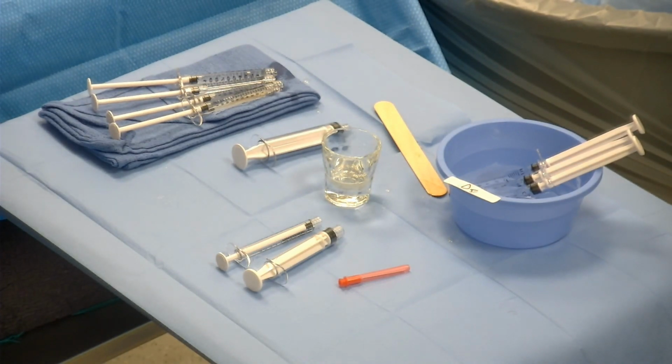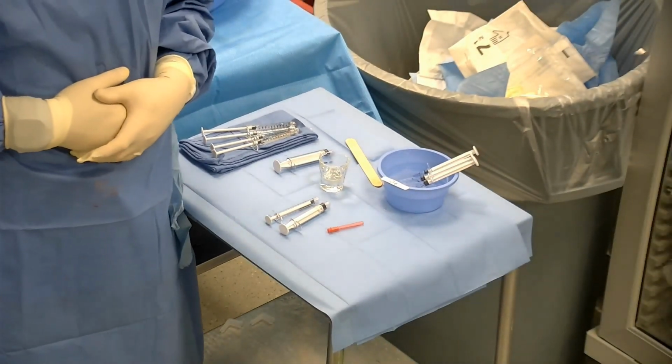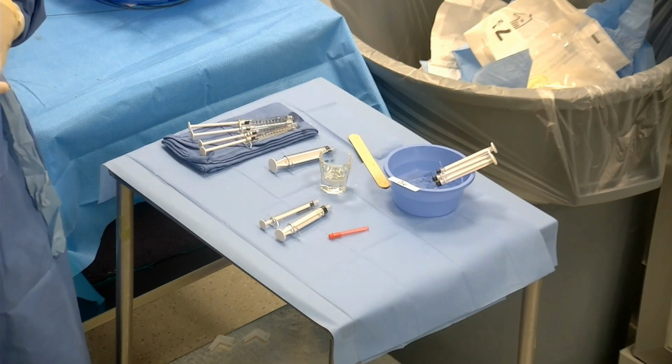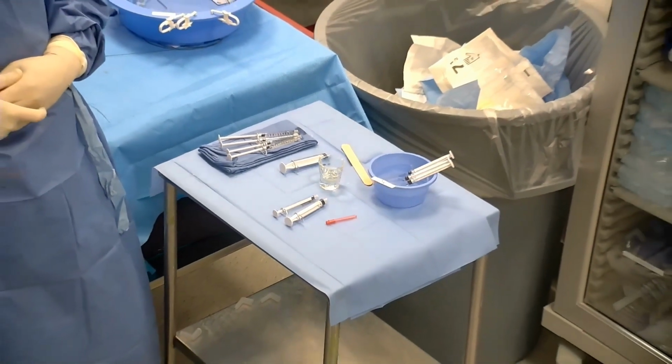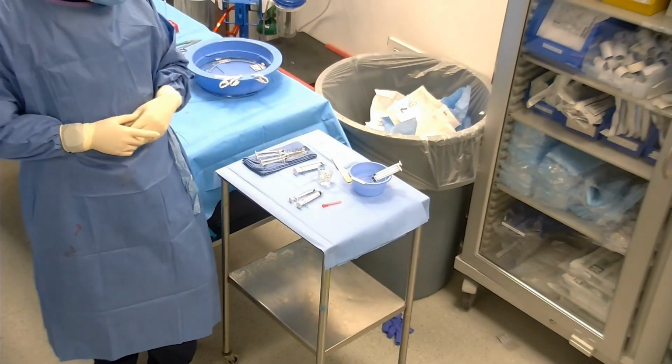There's lots of ways to inject glue, and people that do glue embolization in other territories know this. You could use an aliquot method, or you can just use a push method, which is generally what we do with PAE because we don't want to take too much time switching syringes. We don't have more than a couple seconds before we form a plug.